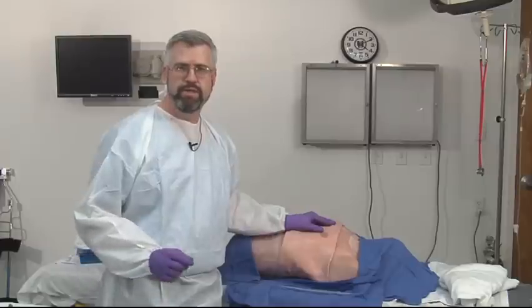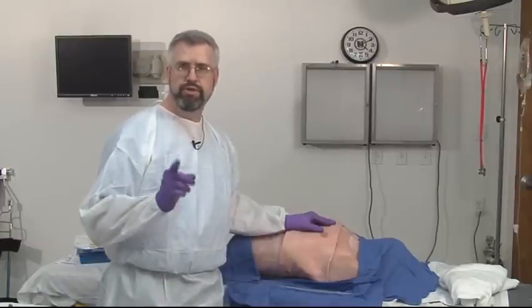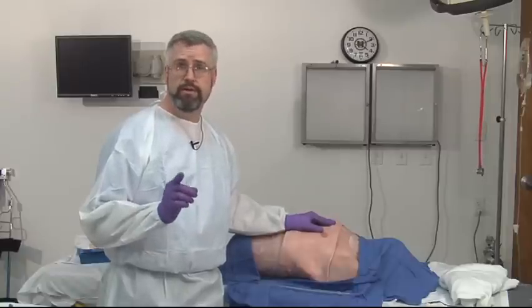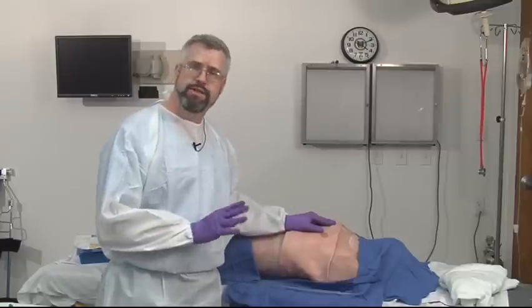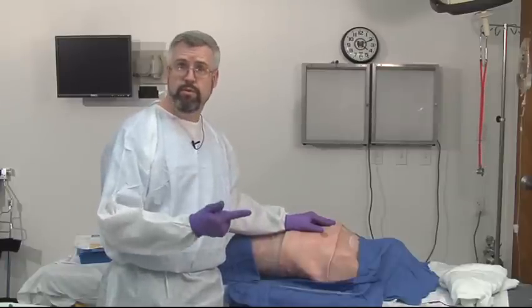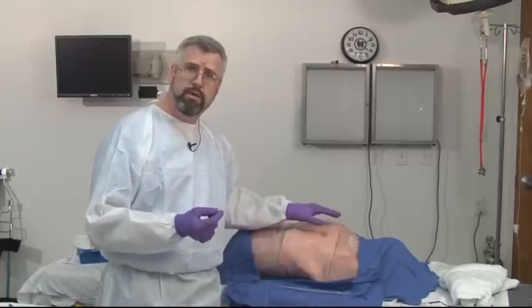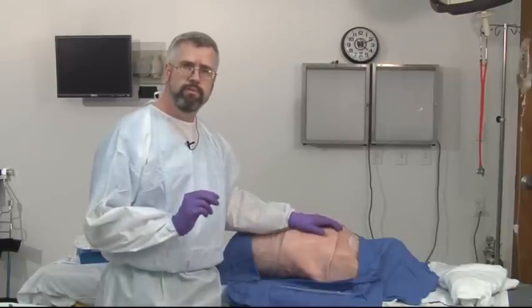The chest tube procedure is something that every physician needs to know how and master, because this is something that you can save a life with. In fact, 85% of all penetrating trauma to the chest and blunt trauma injuries can be treated with just a chest tube alone. Indications for a chest tube are going to be such things as a simple pneumothorax, a tension pneumothorax, or a hemothorax. If you have a tension pneumothorax, you're going to precede the chest tube by putting in the needle thoracentesis, which we taught you earlier.